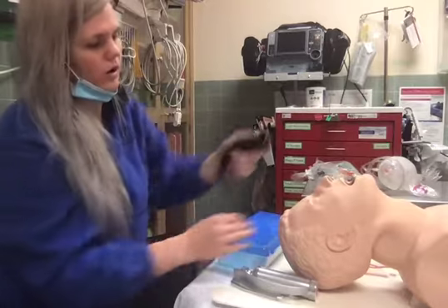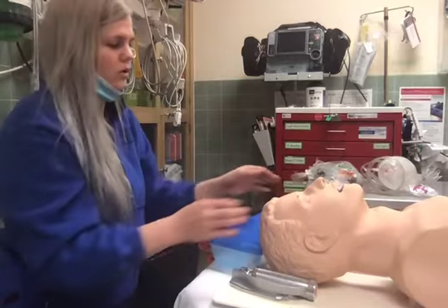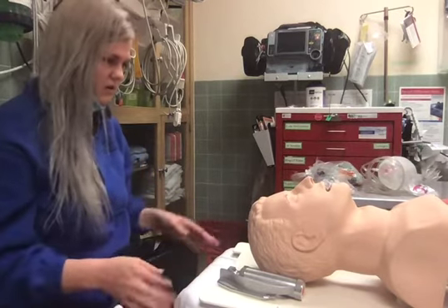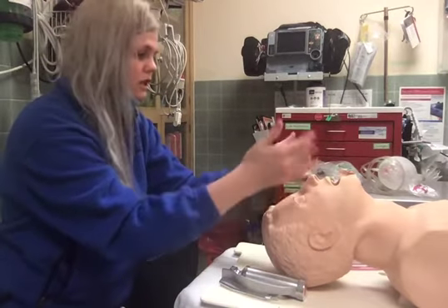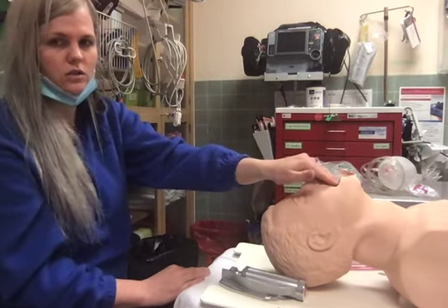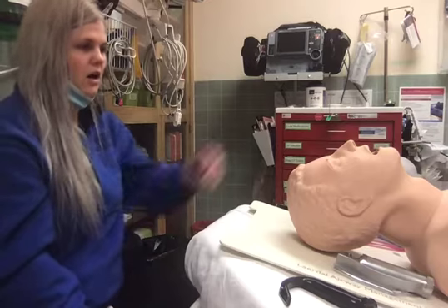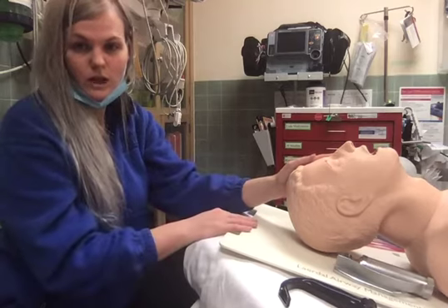One thing I do want to make reference to is these airway heads don't make it super easy to really optimize your positioning. It wasn't until I became part of flight that I stopped struggling with my intubations, because I discovered that I'd been positioning wrong this entire time. Everyone knows the old head tilt, chin lift positioning, but when you are trying to get good visualization of those cords, I found that when you actually raise the bed, you get that 30 to 45 degree angle, depending on your patient. All of a sudden, what was a very difficult airway becomes a very easy airway, even with the old school blades.